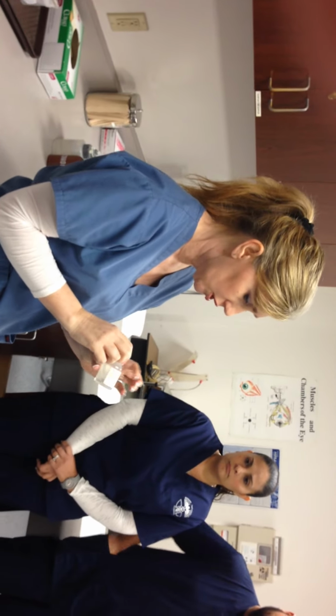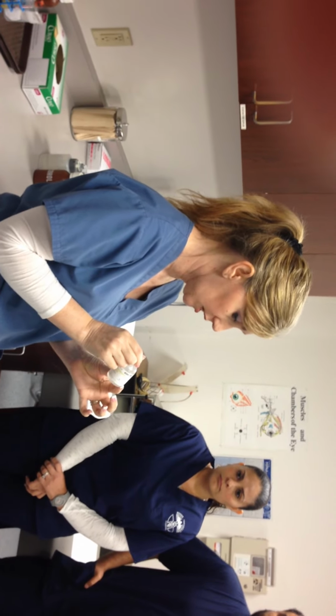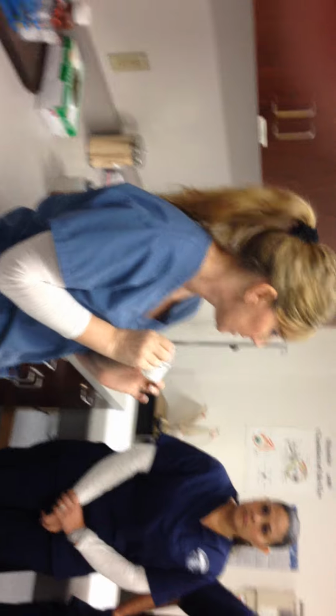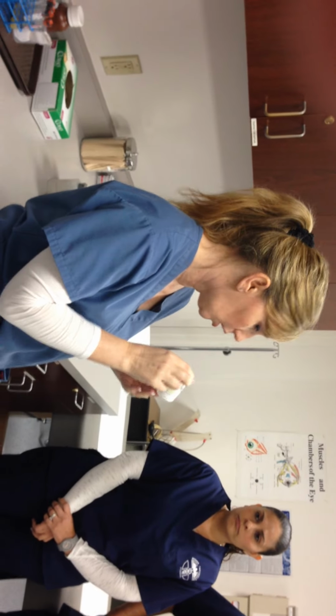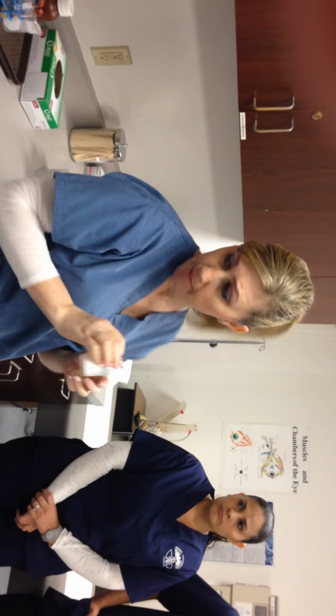So medication, what's the milligram strength? You're going to write down the lot number, checking on the expiration, and also how long is the shelf life. Those are all the things that you need to know about your medication vial, okay?